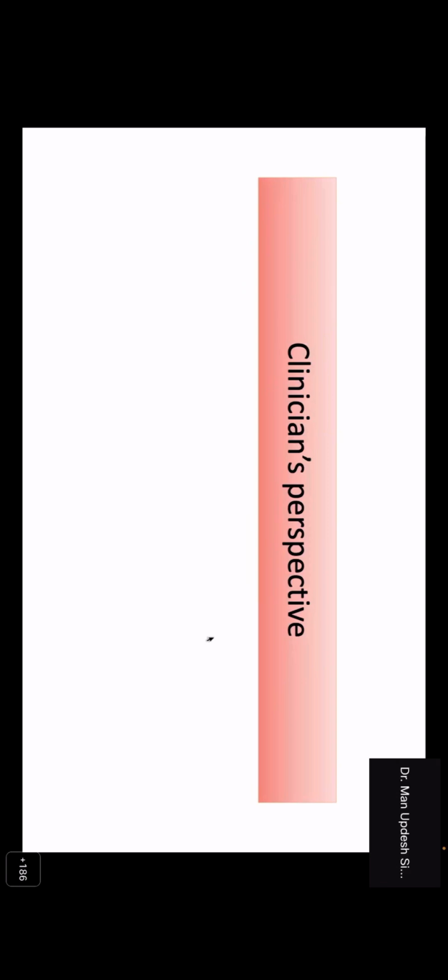So no doubt about the practice conventional guidelines: all nucleated cells. That is the convention. It includes all kinds of nucleated cells, none left, right, in your aspirate when you give the count. So don't exclude the erythroid series of cells. Don't exclude your plasma cells or some histiocytes, if they are there in your count. So the bottom line is all nucleated viable cells you are seeing on your microscope.